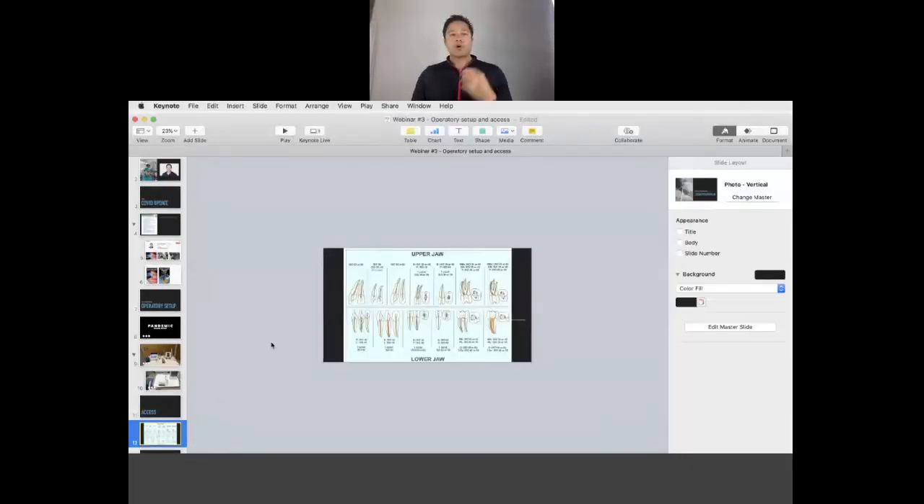With regards to access — we've talked about setting up. Now we're going to talk about access. I only have about 20 minutes, so I've got two videos and it's really going to be about the two critical things. I'm going to put up two situations: a mandibular molar — because that's the one that causes the most grief — and everyone wants to find MB2. I'm going to show a couple of tips about that and we'll go through the mandibular molar.